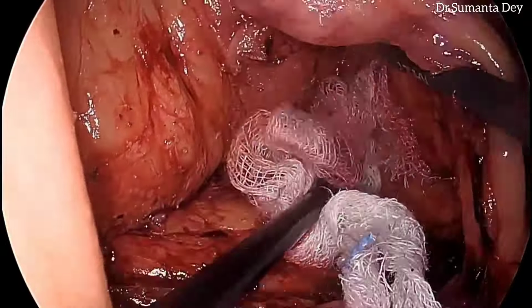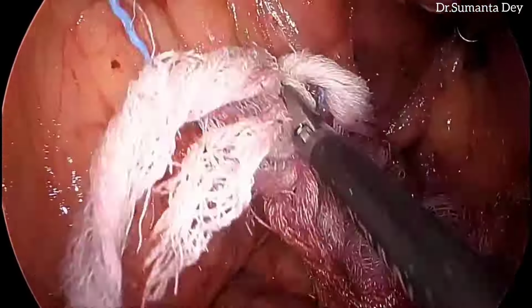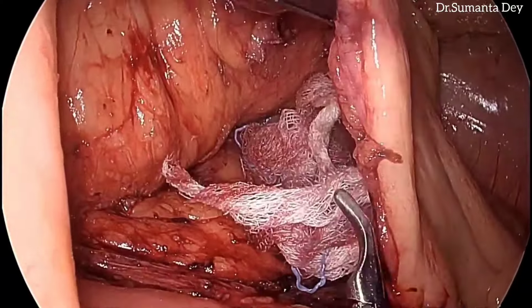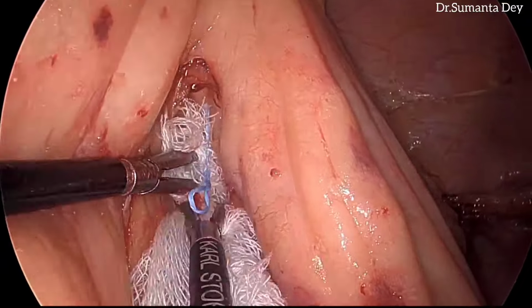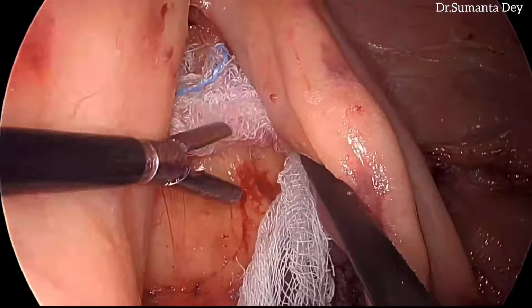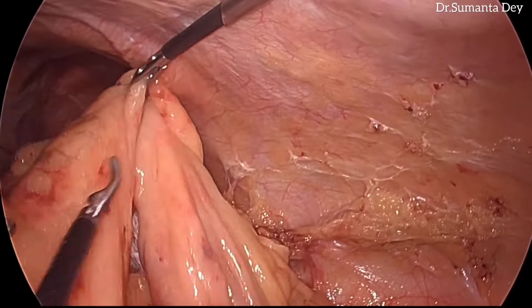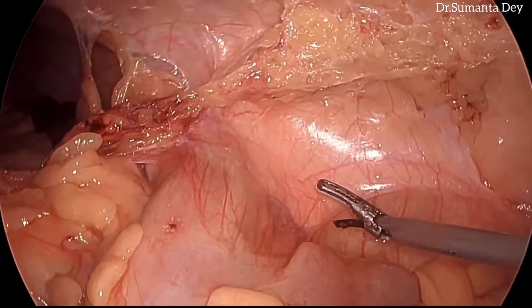After completion of the medial to lateral dissection, I have kept a gauze piece at the lower border of the pancreas in between the mesocolon and the perirenal fat, and then took one more gauze piece which I have kept through the window in the mesocolon into the lesser sac. And now I will come to the supracolic dissection.